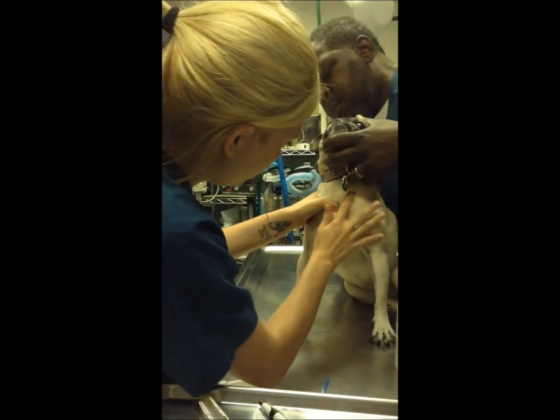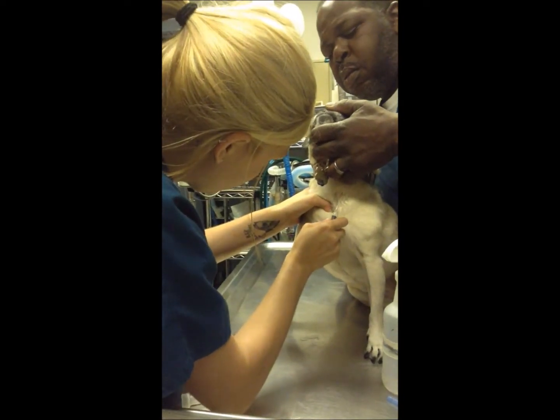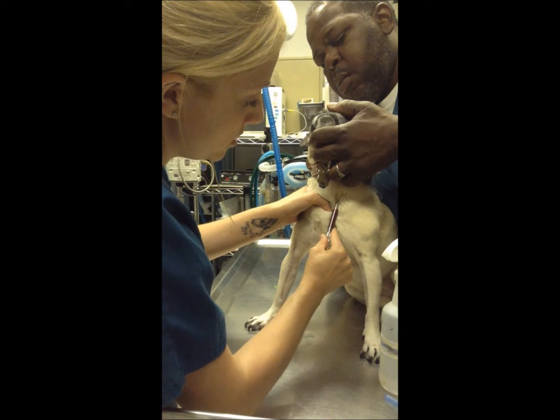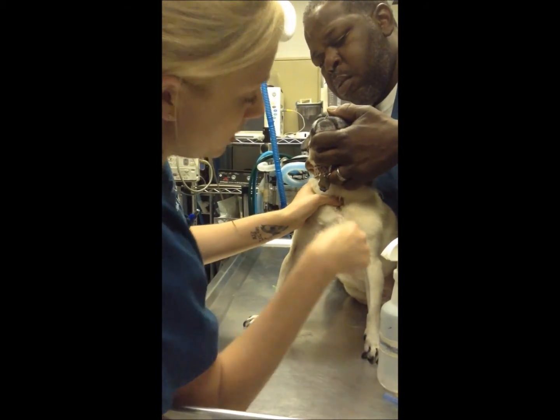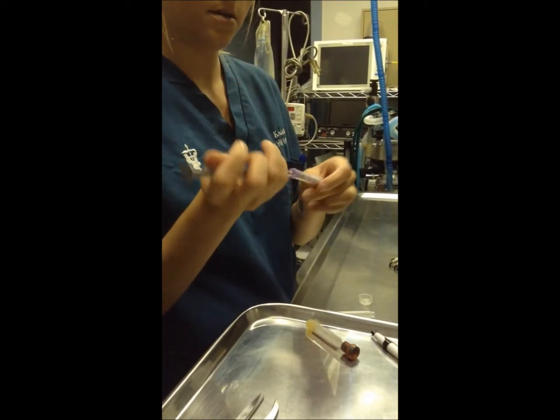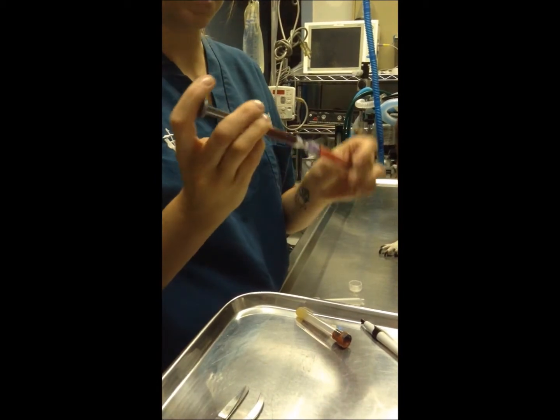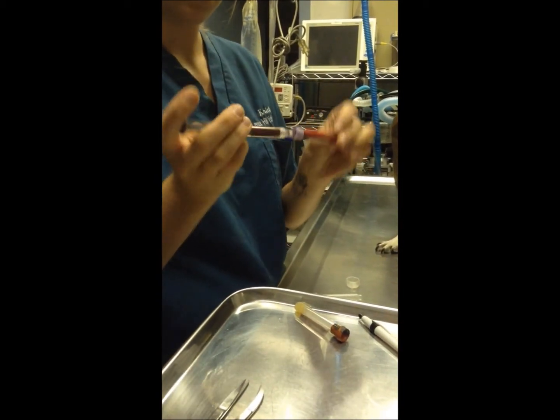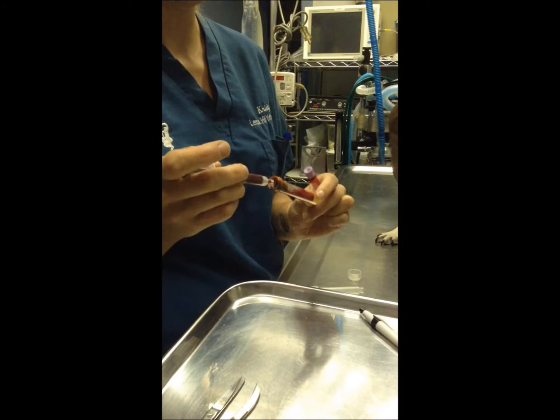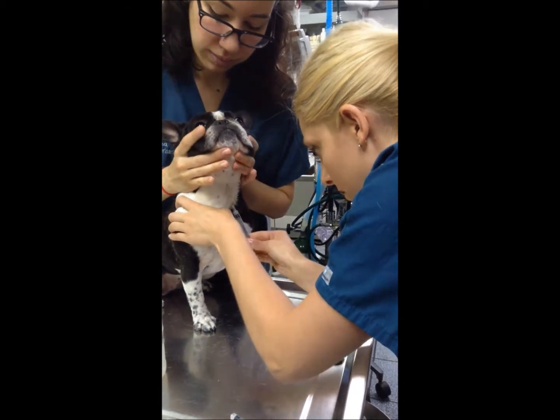We're going to get blood from Ethel for our recipient sample. And usually you need about 3 cc's to fill both syringes. Again, we're going to put one part of the blood in the lavender top and part of the blood in the serum separator, and you allow the serum separator to clot before spinning it down, usually about 10 to 15 minutes. And you rock it back and forth so it doesn't clot, and then you put her name on the vials as well.